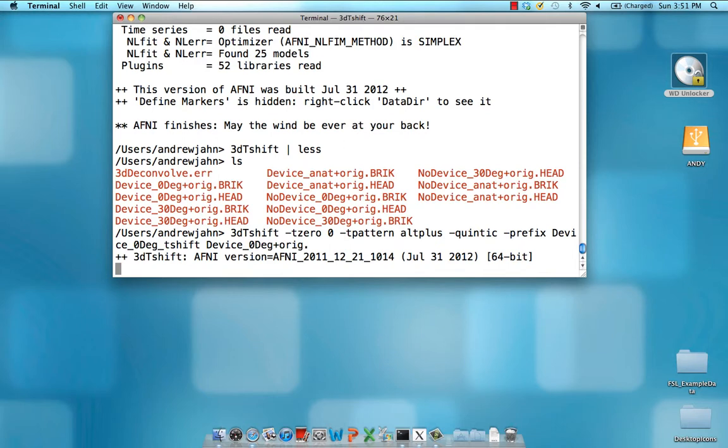It takes a few seconds to think. And as you can see, it's a very quick process. There's no need really to do any lower interpolation methods, such as the linear, which might lead to more smoothing in your time course.